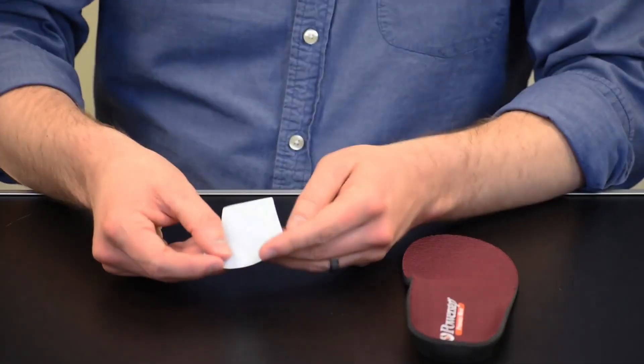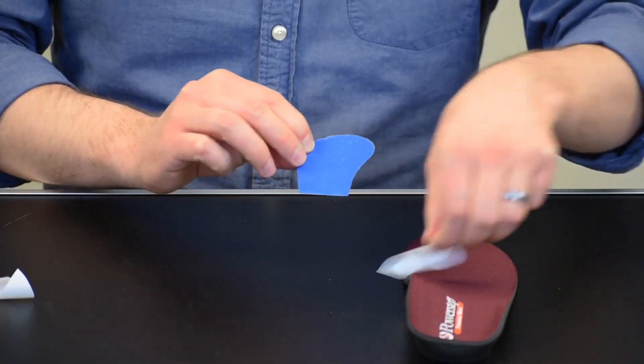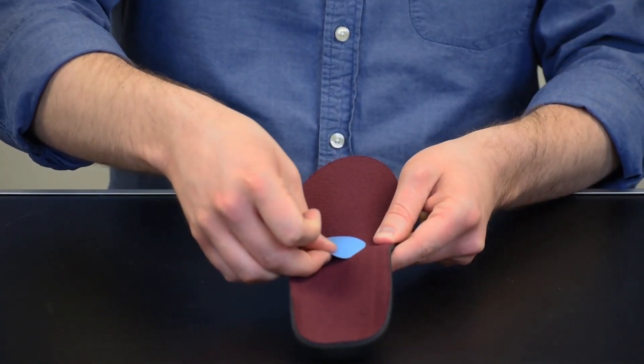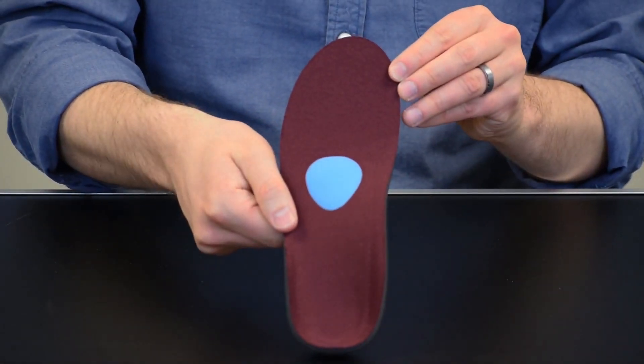To apply, select left or right if designated and remove the adhesive backing from the cushion. Apply firmly to the top of the orthotic with the support just behind the metatarsal heads. This will help spread them and relieve unnecessary pressure. Adjust the position as necessary for comfort.